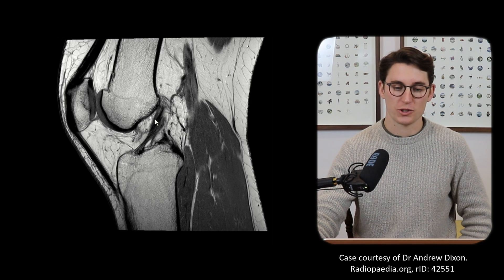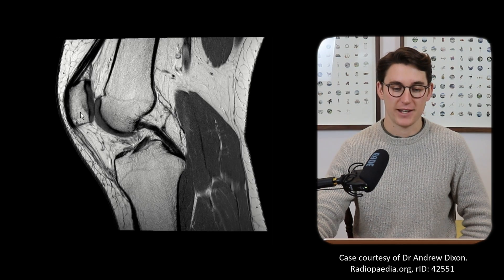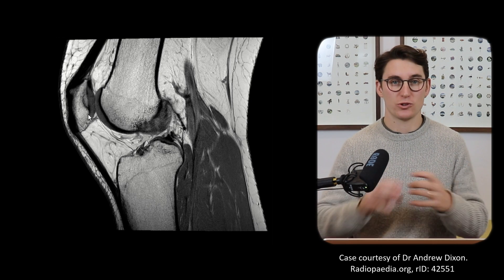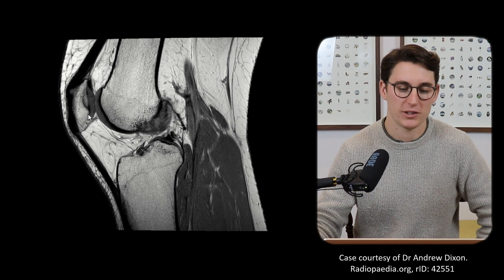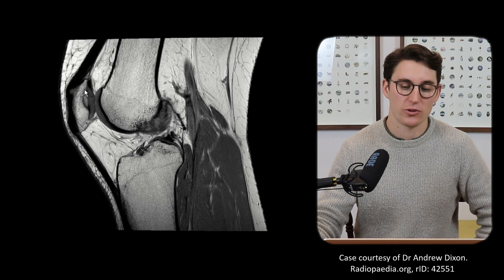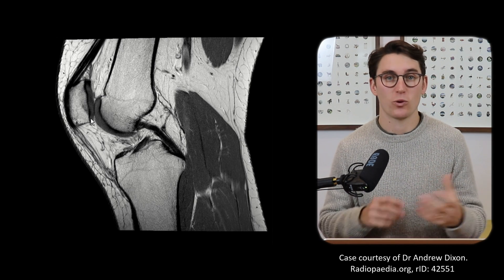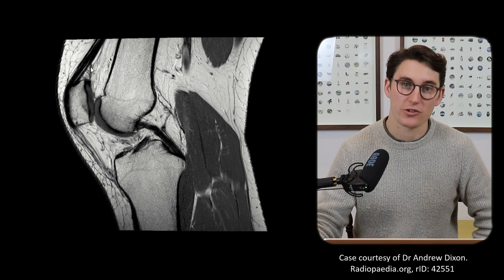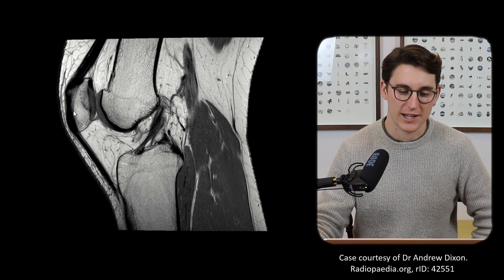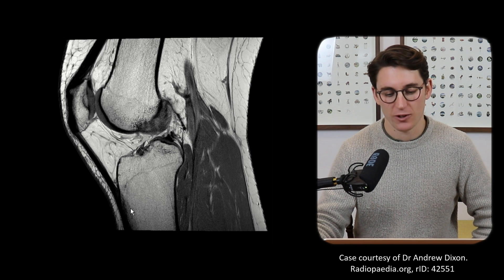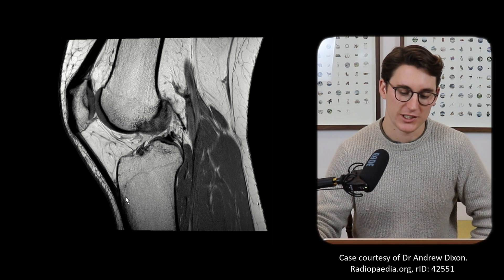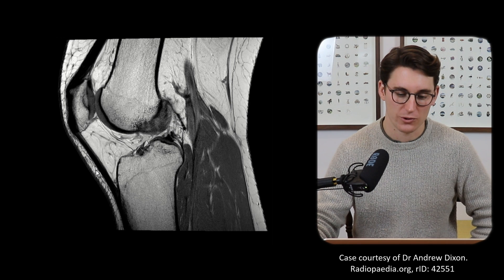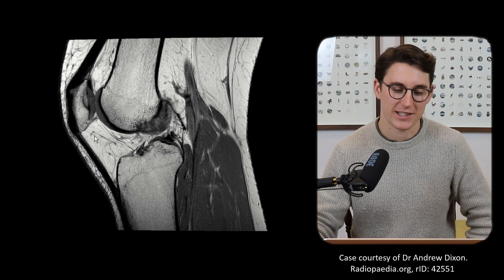Scrolling through those bones, we can also have a look at the patellar bone. Sometimes a patella is divided into two portions — a bipartite patella — or sometimes even more, a multipartite patella. Those are both normal anatomical variants. You mustn't be tricked by that and call it a patellar fracture. We can look at our extensor mechanism here: we've got our quadriceps tendon coming down to our patella, and we can follow the patellar tendon all the way down to our tibial tuberosity on the anterior surface of our tibia. We want to make sure this has low signal all the way through, with nice thick bands and no disruption of that extensor mechanism.